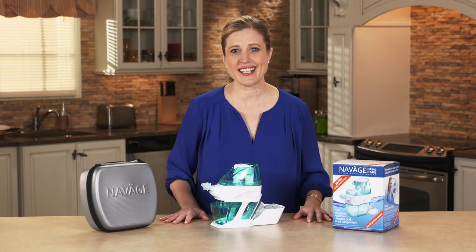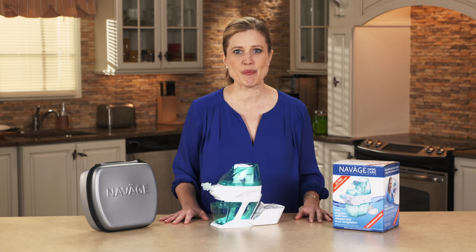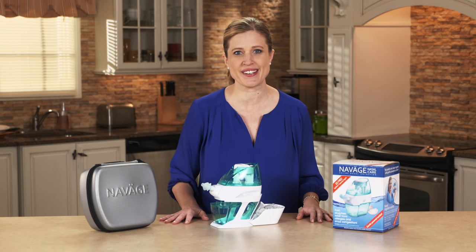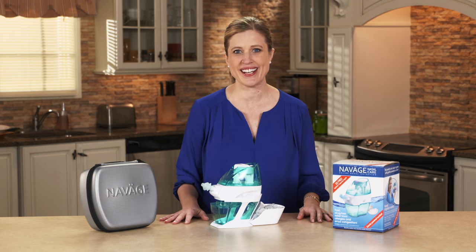Most people find it easy to get started with Navage, but if you have any questions please call our customer service department. Our customer service representatives are daily users of Navage and they're eager to help you get started. You're now on your way to a lifetime of better breathing with Navage nasal care.